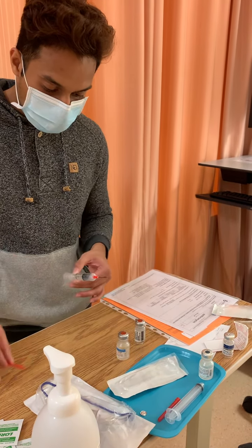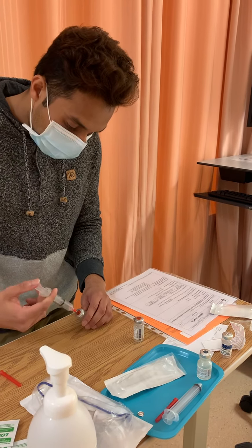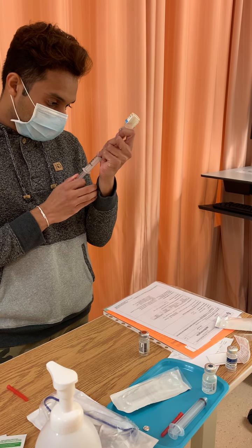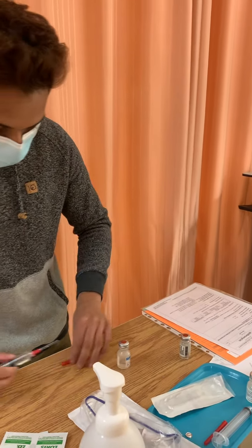So we already swabbed it, and we're going to draw out the 4.8 ml of sterile water. We're drawing up 4.8 ml of sterile water. We're drawing a bit of excess so we can get rid of the air bubbles.